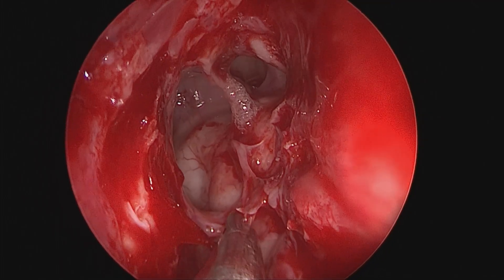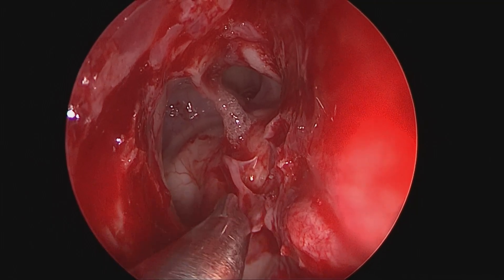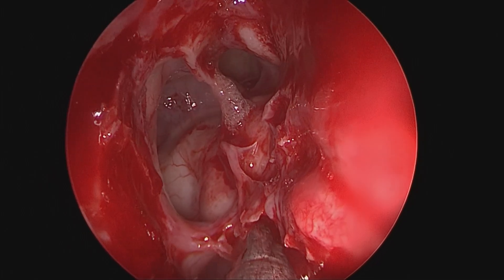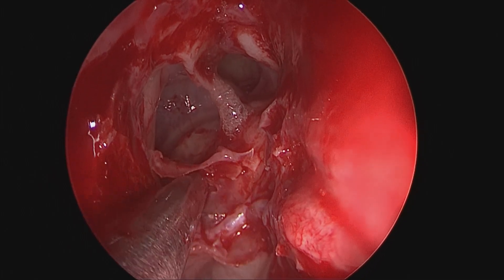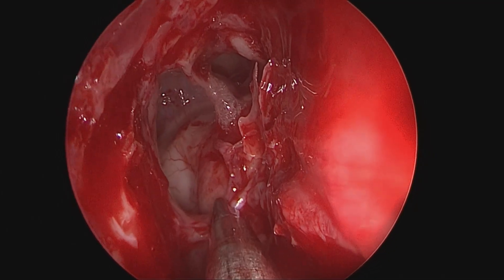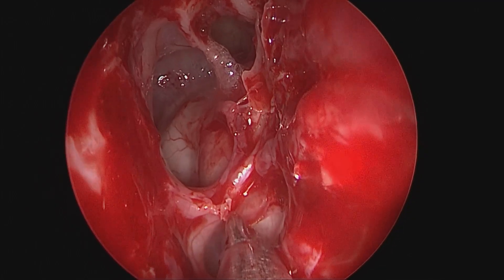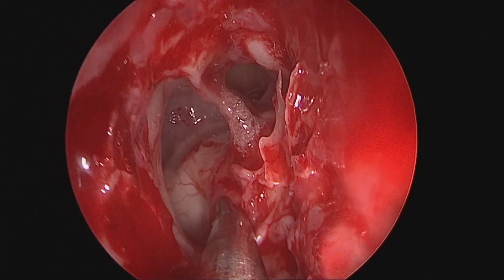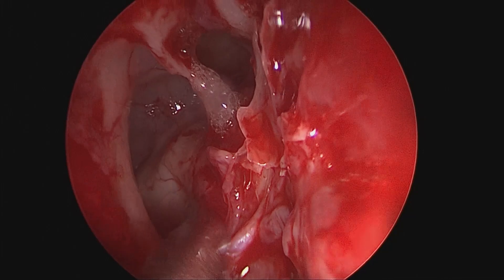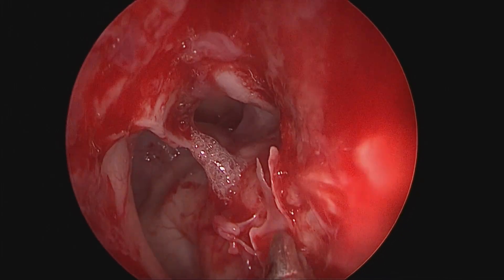This is a broad opening of the frontal sinus and gives a lot of security in the post-operative period — it can be irrigated very well for healing. No bare bone has been created; some small bone chips can be cleared using forceps, and behind the navigation tip one can clearly visualize the anterior ethmoidal artery.